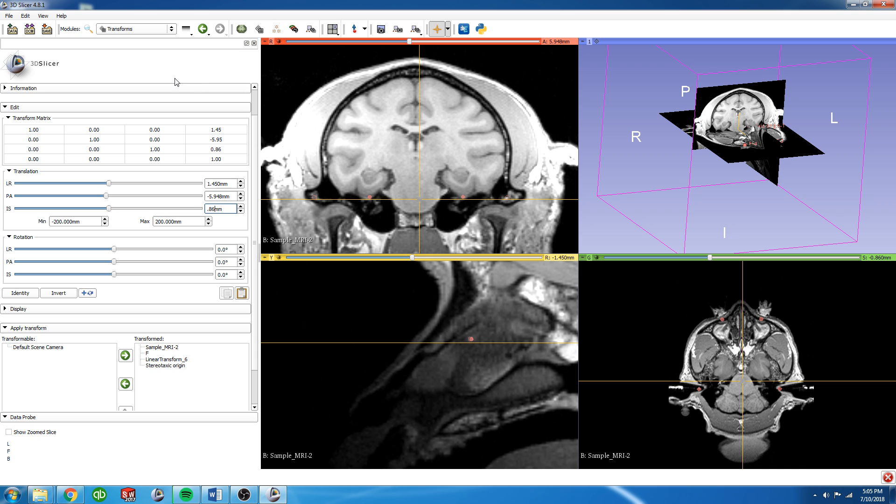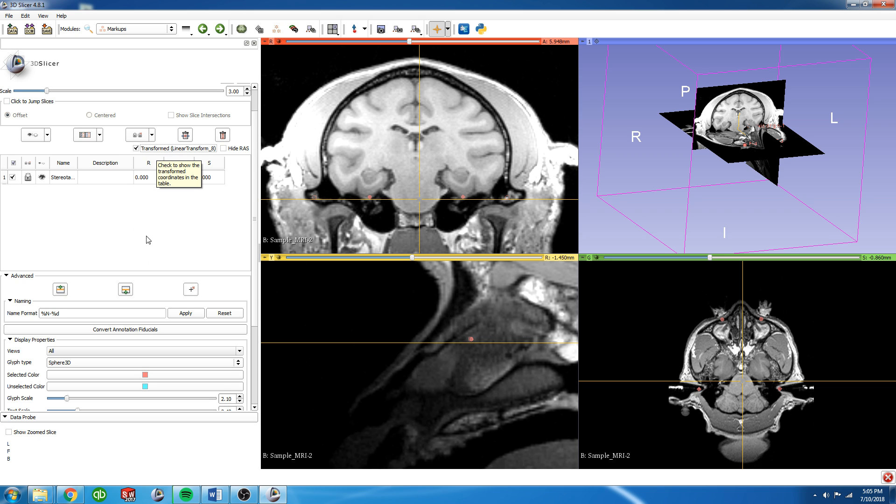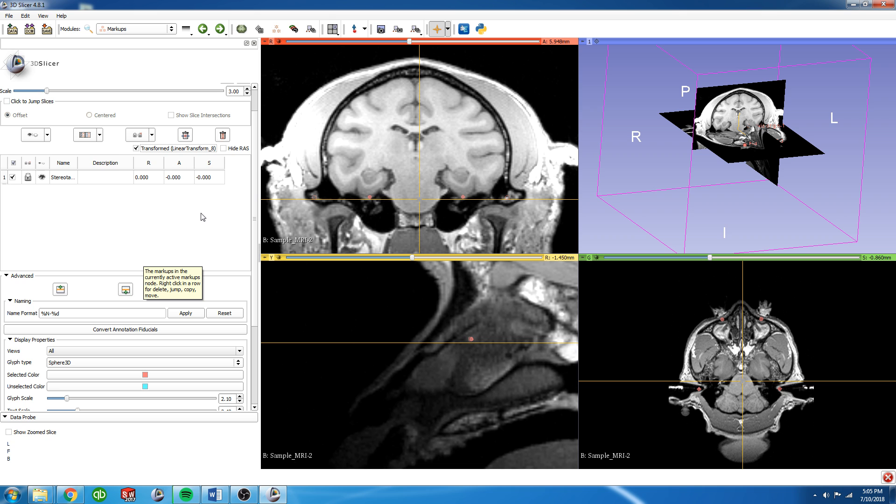From here, before we harden anything, we're going to go back to the Markups menu. This box is already checked. It may or may not be checked for you. Go ahead and check that for Transformed. And you'll see that when this is transformed, that fiducial is now located at 0, 0, 0, which is exactly what we want.